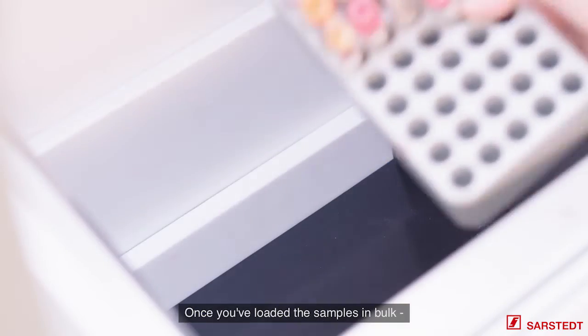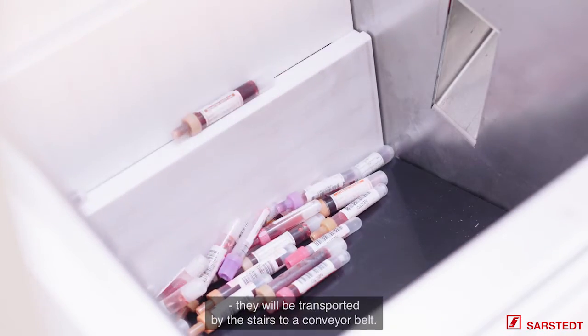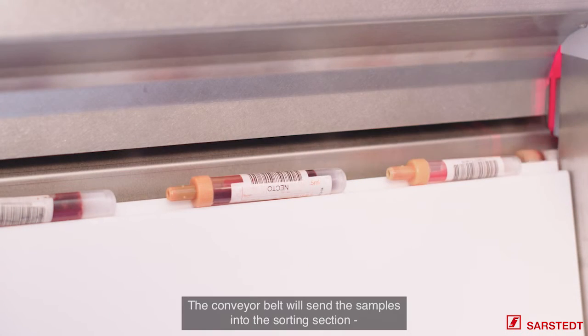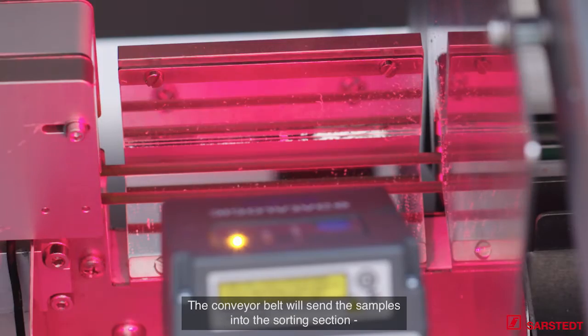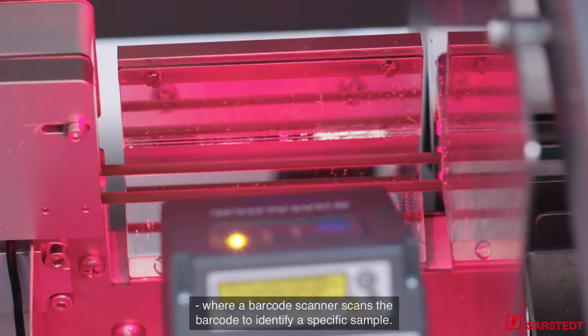When you have loaded the samples, the samples will be in the bulk. They will be transported with a stair to a conveyor belt. The conveyor belt will send the samples into the sorting part, where a barcode scanner scans the barcode to identify the specific sample.